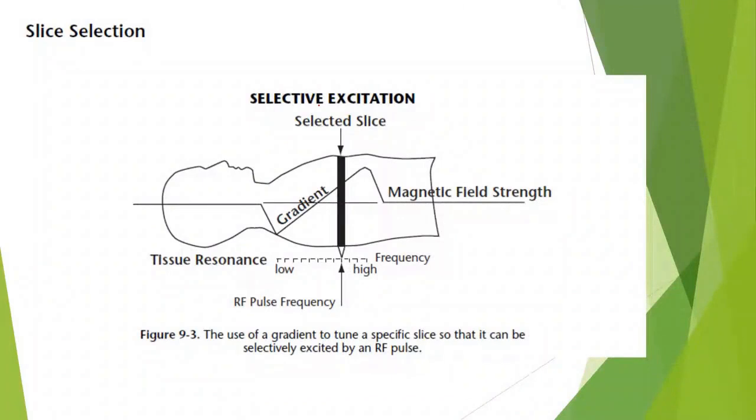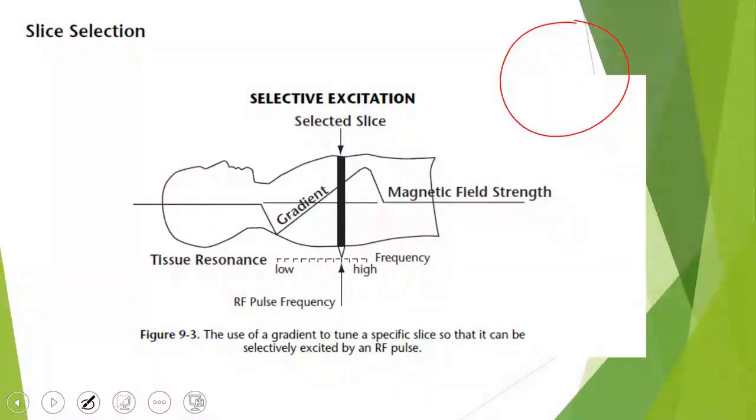I said that I have a set of RF pulses and I know the frequency, so let's apply the RF pulses through your coil and perform excitation. After that, stop the RF pulses, perform relaxation, and receive the signal. It is not easy like that. It's not as simple as you might think, as you will encounter some issues.